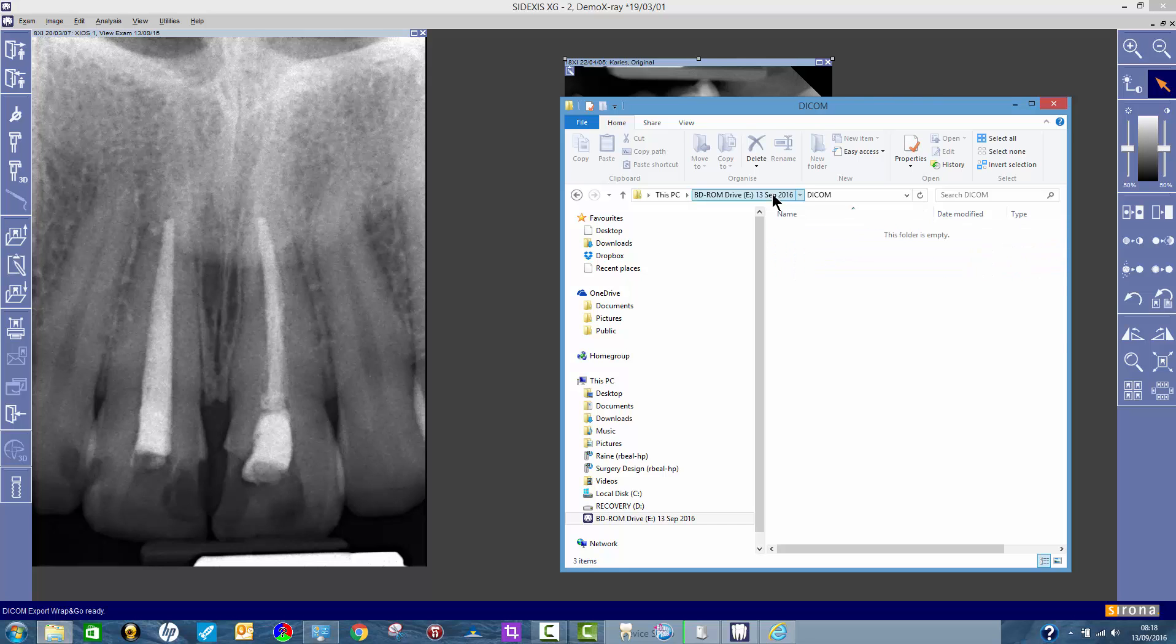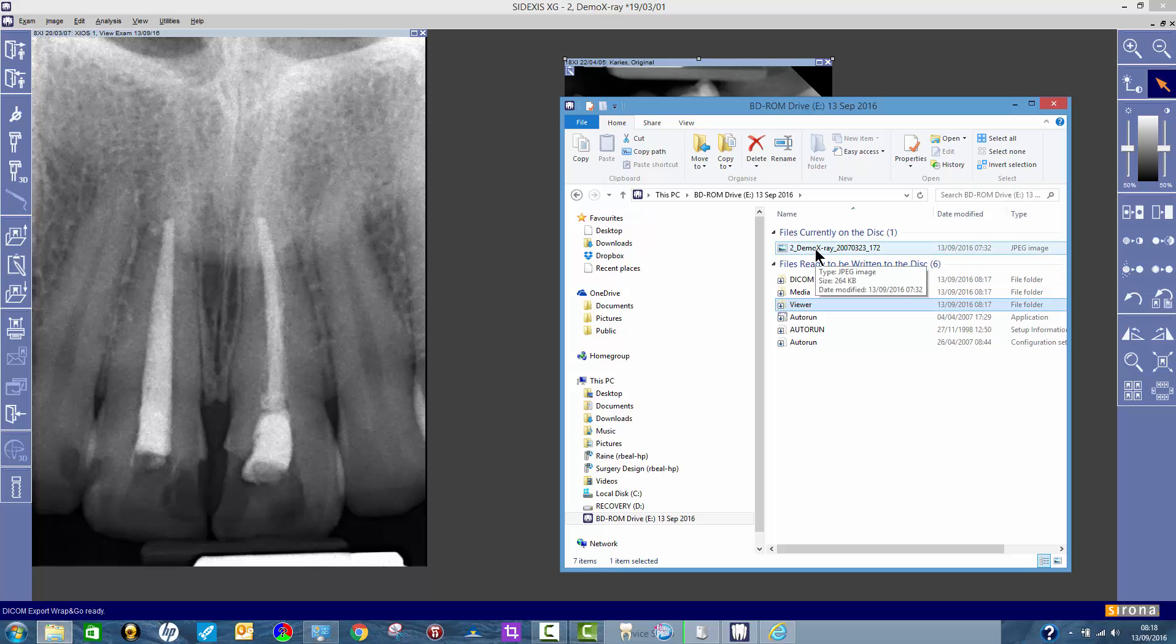If you want to send it to a patient that they can view at home, they will be able to view it as the JPEG anyway. If you just burn it like I've shown you how to do, then you get both options on the same disc.